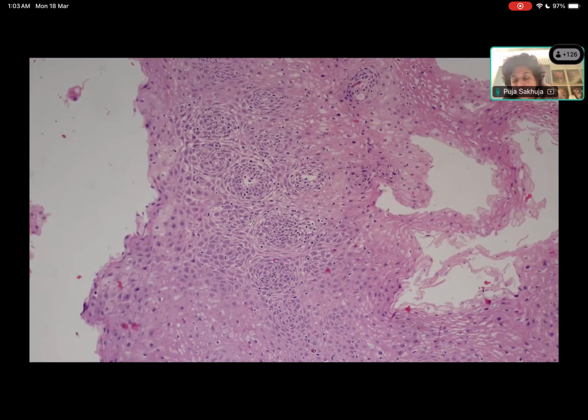Normally these basal cells are there in the lower 1/3 or half of the squamous epithelium. So when these basal darker cells come above that, and the subepithelial papillae come up again into the upper 1/3 of the squamous epithelium, that is a change. And normally where are mitotic figures? This is an epithelium, so it keeps proliferating. Mitosis is obviously going to be seen, but only in the basal part of the squamous epithelium.